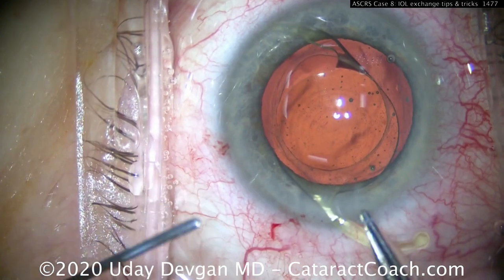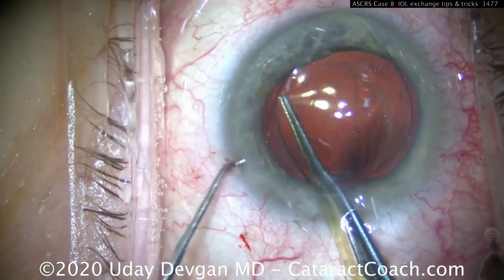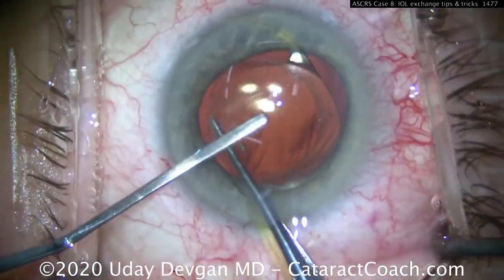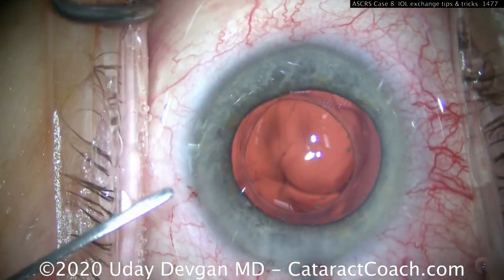Holding the lens at the optic edge, using a chopper to help secure it for a better grip. The spatula goes in to protect the endothelium and help roll the lens. We just twist it and it comes right out of the eye — it looks very easy.